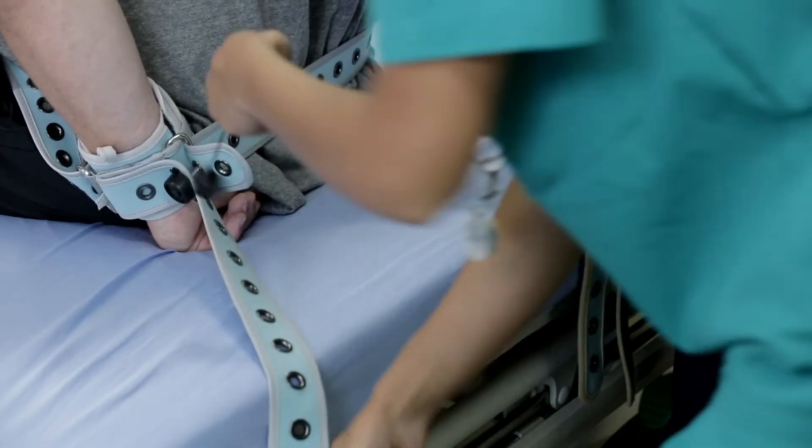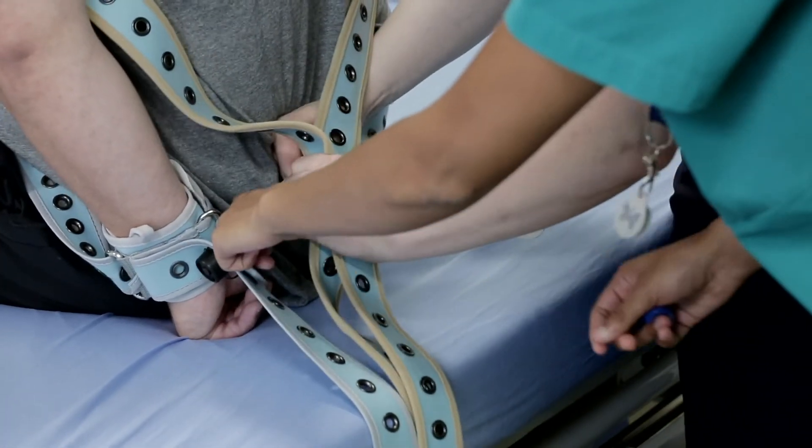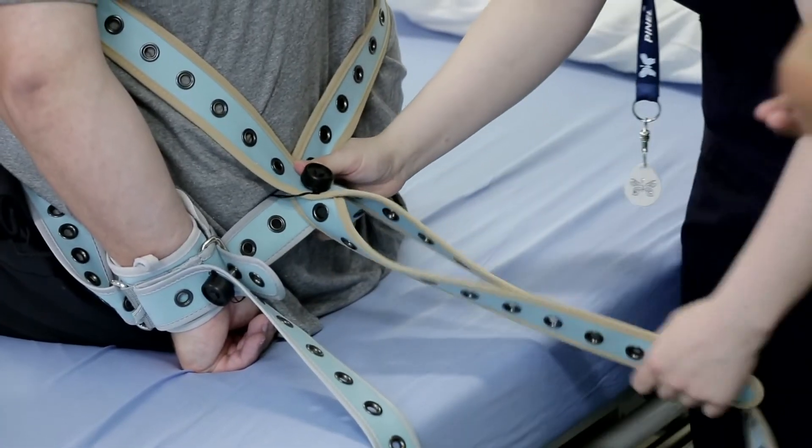For very aggressive patients, connect the bed strap to the wrist strap with a button. This prevents the patient from pushing the wrist straps down, stepping out of them, and using the straps as a weapon.